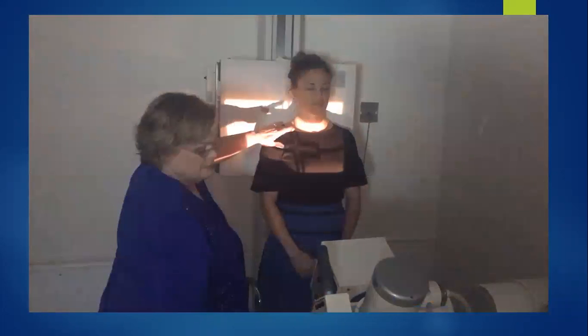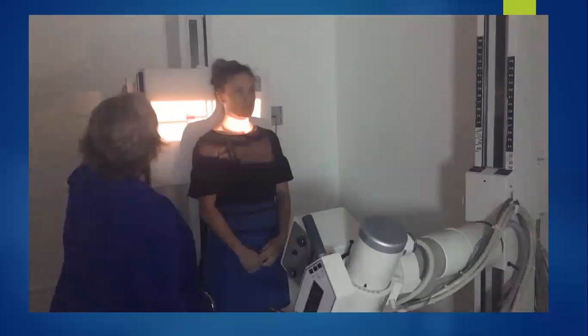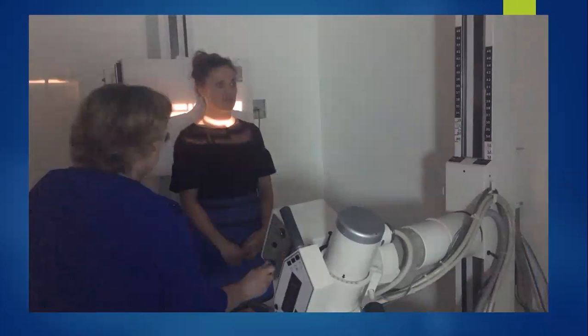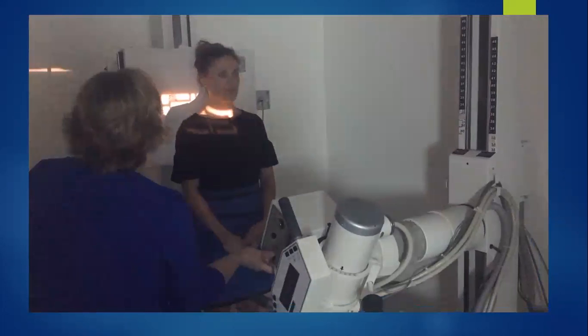And when you center and you look in that big angle, it's going to make the light field diverge bigger, so you can just manually adjust your collimation to the clavicle. The axial view is going to throw the clavicle up off the apex of the lungs, and we're going to look at that in the x-ray next.